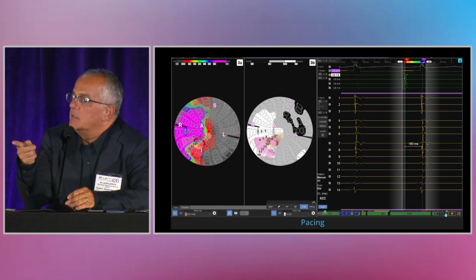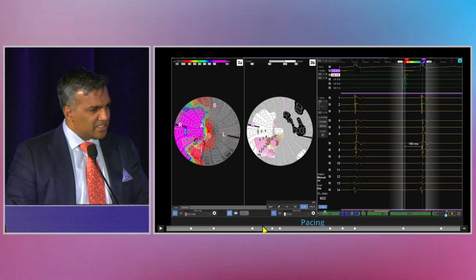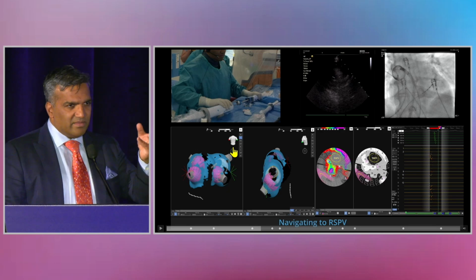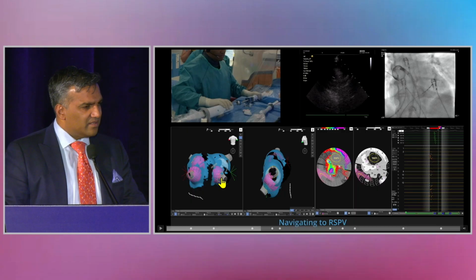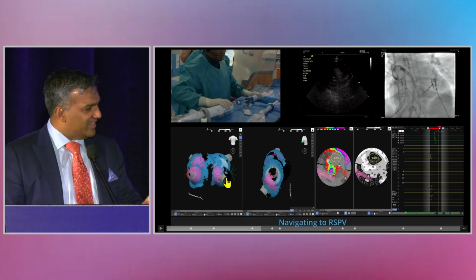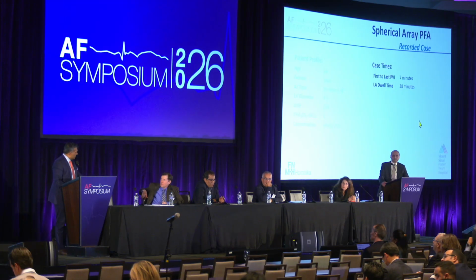And when you're showing the left atrial map, those veins are fake veins, right? Yes, good point. Let me put that up here because I think that's an important point. These little tubes here, obviously, we didn't put the balloon inside of the veins. Remember the old CARTO system with the little tubes? It's sort of like that, just to make it easier to understand where things are. And it's based on the no-contact region in the center? Is that how you decide where the vein is? Yes, that's right. It looks a little weird, but after a couple of cases, it's pretty straightforward.